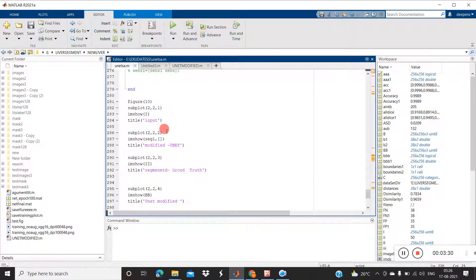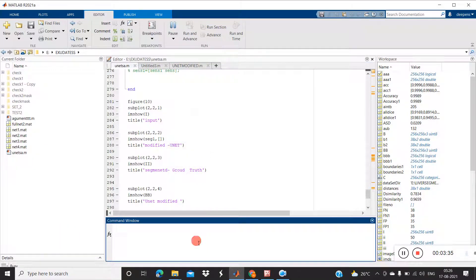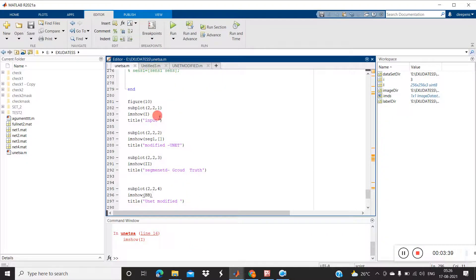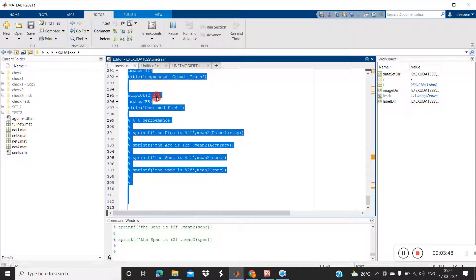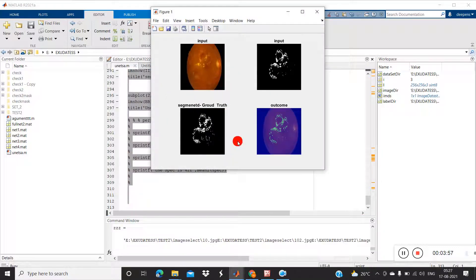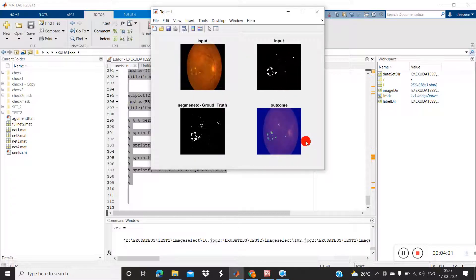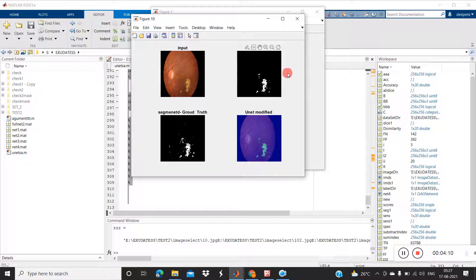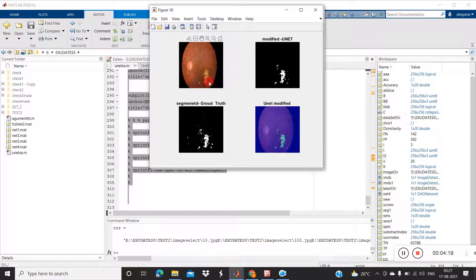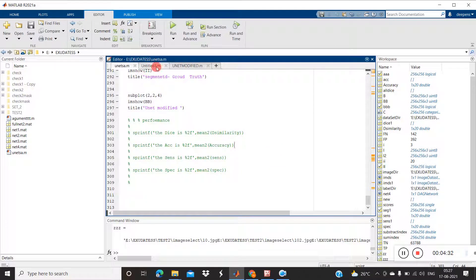I am running the program here. Training takes too much time, so I already trained the model and I am just loading it. This is the result for exudates of fundus images. The first one is the input image, this is the outcome of U-Net, this is the ground truth, and this is the labeled outcome. You can see the exudates present in the image are segmented out. Different colors are allotted for background and exudates.